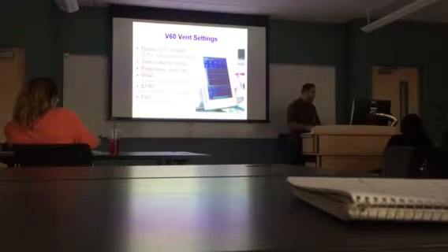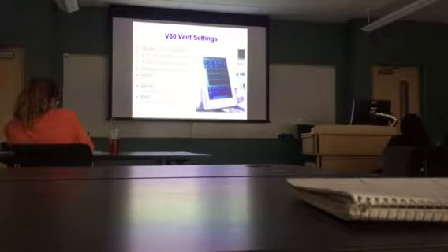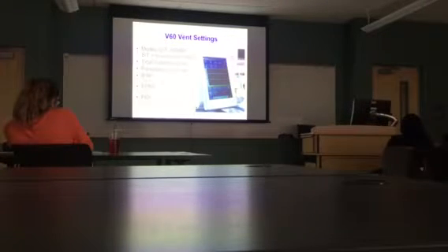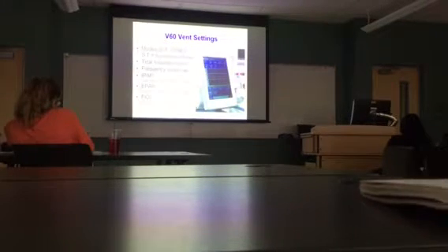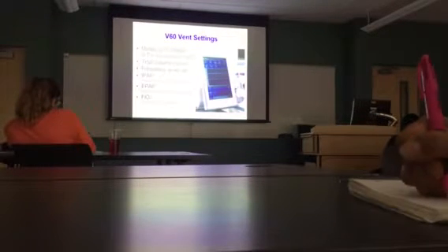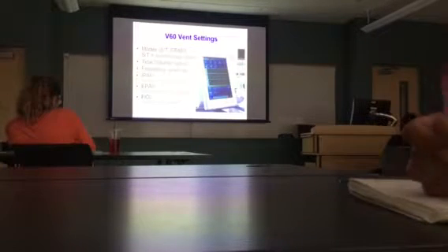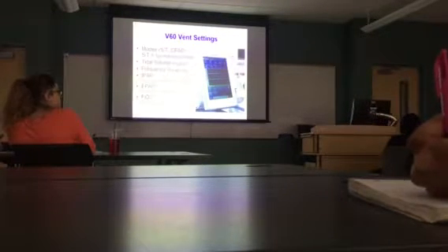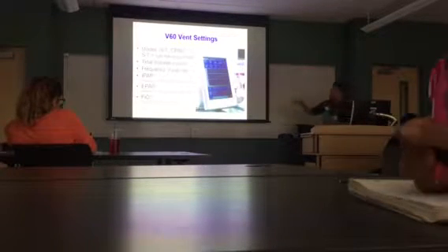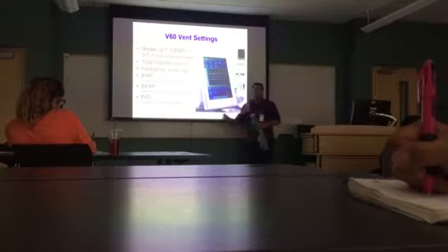So IPAP, let me grab it really quick. This is non-invasive, right? IPAP is going to be a value that you're going to touch and turn. There's the IPAP right there. I'm going to touch it and turn it to whatever number I want.